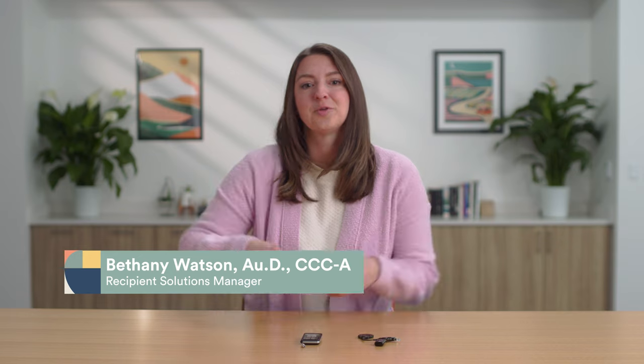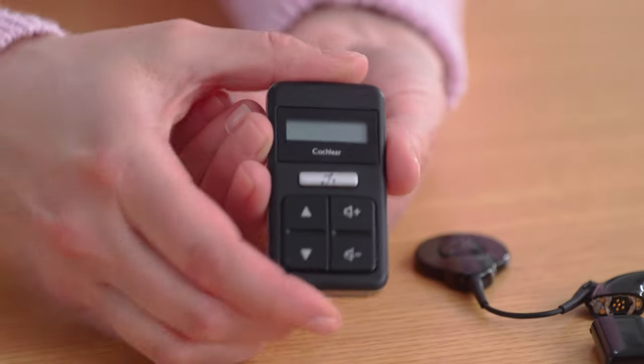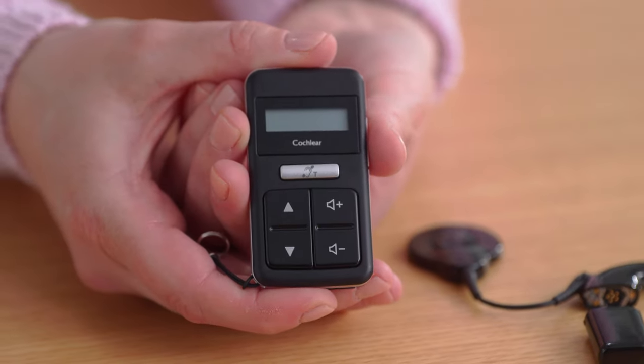If you don't have a smartphone to utilize the Cochlear Nucleus Smart App, then the Cochlear CR310 Remote Control is an alternative to make basic adjustments to your Nucleus 8 sound processor. In order to use your remote control for the first time, you'll need to pair it to your Nucleus 8.